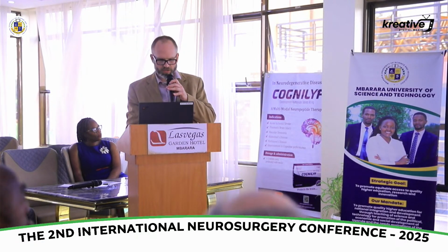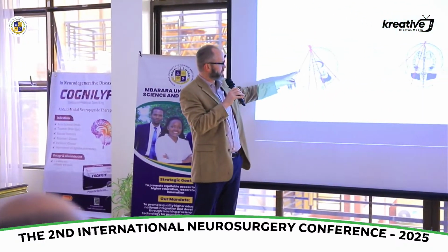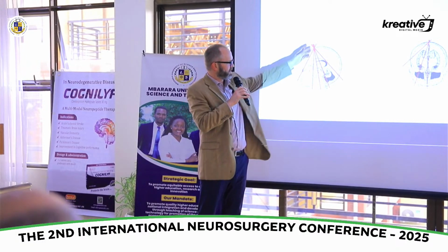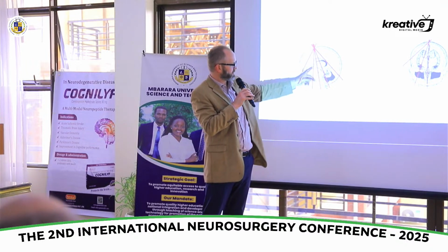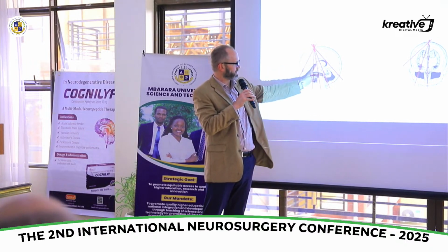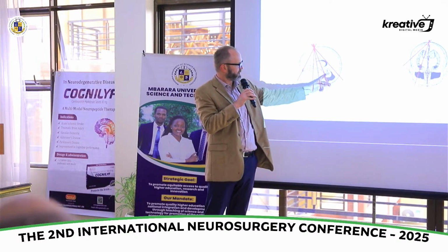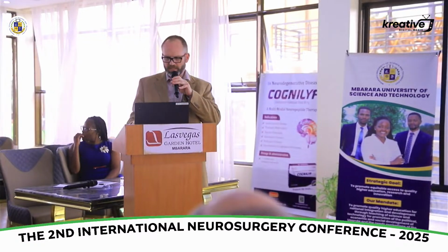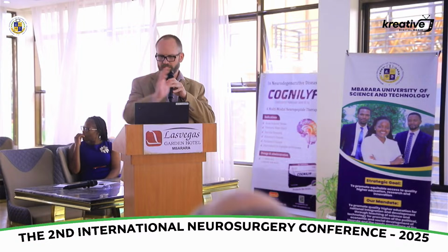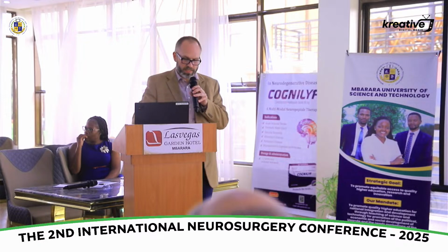It's easier to show here, where first you go through the frontal lobe down to the orbital roof, then you come back through the lateral ventricles at the anterior commissure, at the optic chiasm, then back at the anterior commissure, and then back to see the brainstem and the cerebellum, and then finally get a posterior one, the entire neonatal brain. And on the coronal view, you get 5 images. This just shows one side, but there's 2 others on the contralateral side that are picked up. And this has all been standardized.